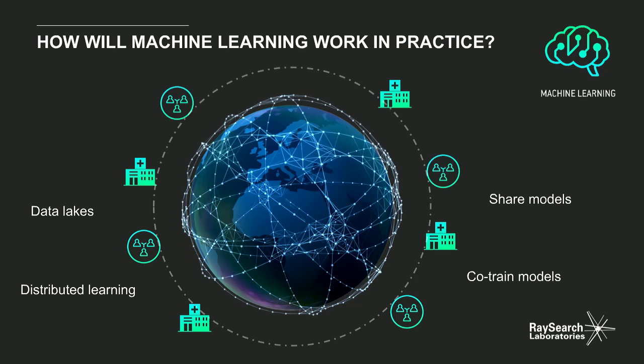Machine learning has great potential as a good way of sharing knowledge. If you have a clinic with a lot of sites, you could get the same treatment regardless of site. Large clinics that have a lot of knowledge of certain treatment sites can transfer that knowledge to smaller clinics through machine learning models, so the smaller clinics can generate similar treatment plans as the larger clinics.